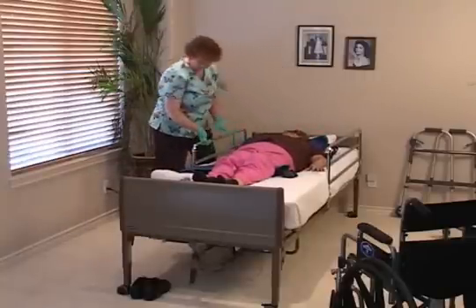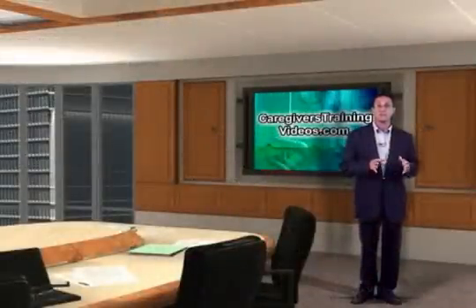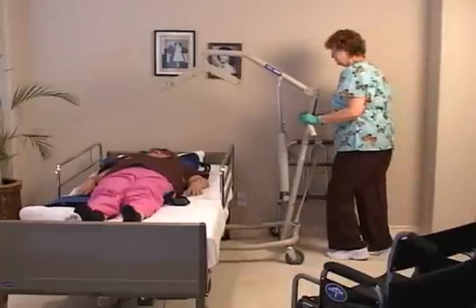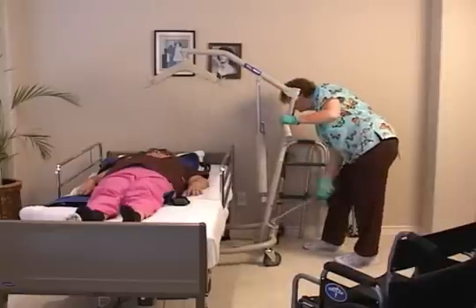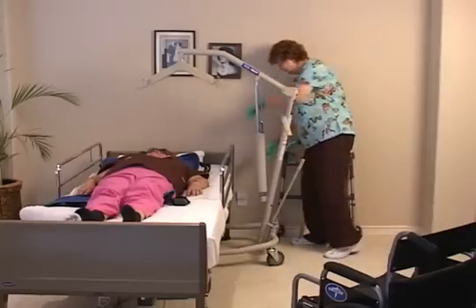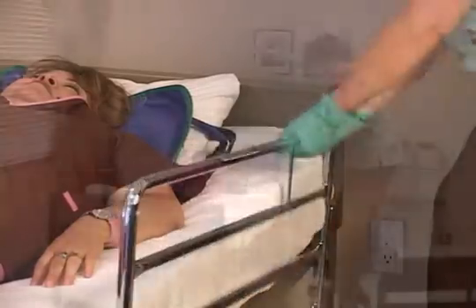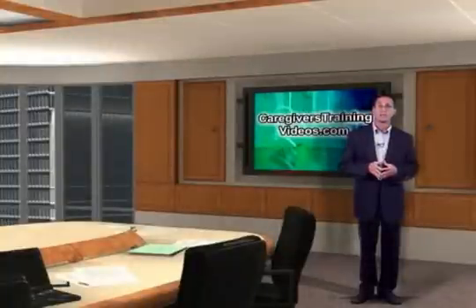17th, since the bed rails are secure in the up position, you can steer the manual hydraulic lift near the bed. 18th, open the leg base. 19th, ensure the boom level is higher than the patient to prevent any injury. 20th, lower the bed rail on the transfer side.